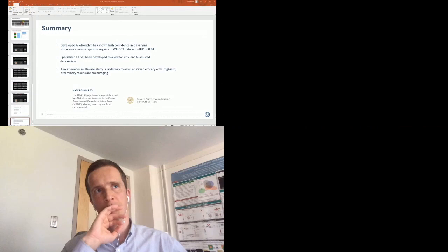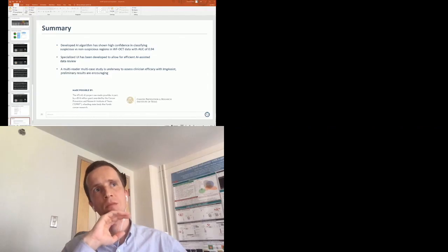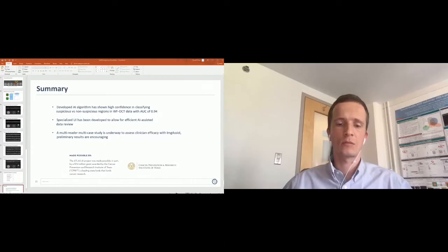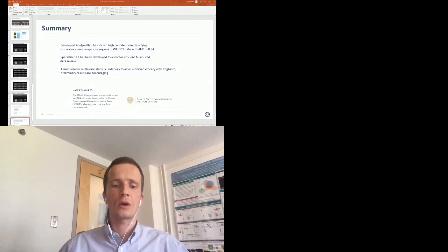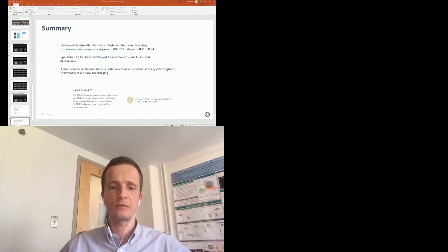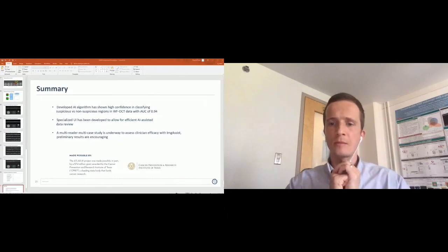So if the margin is clean within 2 millimeters, then it's a good indication that it's clean and no second surgery is needed. So this is where I think the approach is viable. Okay, so you're basically limiting the depth that you analyze to about 2 millimeters. Yeah, that's correct. So the patches are only extracted from the top, yes.